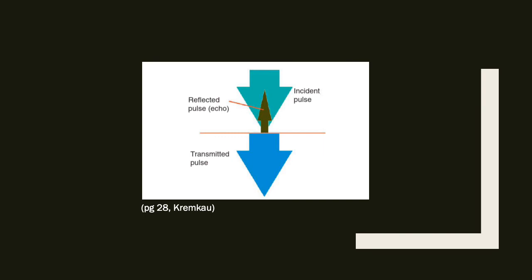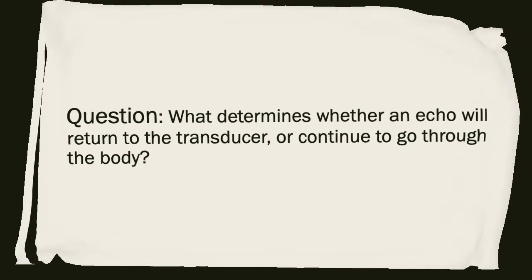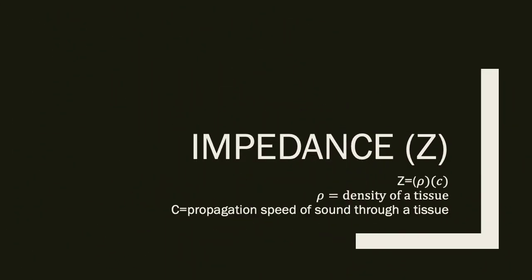Now, I can really only imagine that everyone is dying to find out what exactly influences whether or not our sound beam gets reflected back to the transducer or whether it continues. It's a really, really brilliant question, and I do actually have the answer for you, and it's the difference in acoustic impedance.